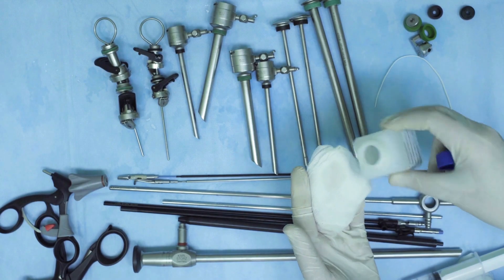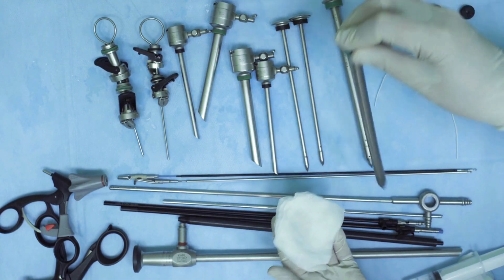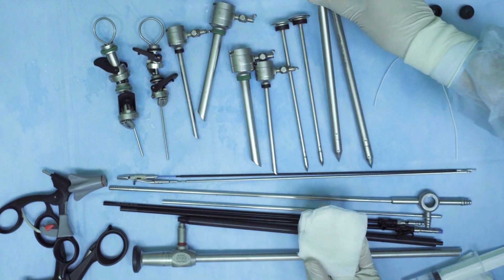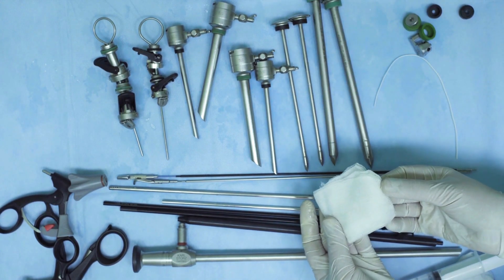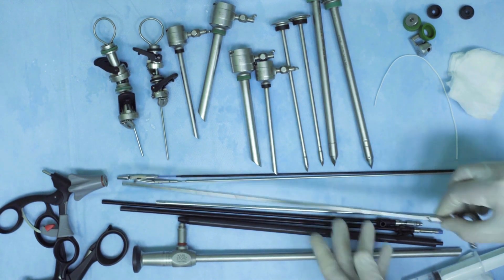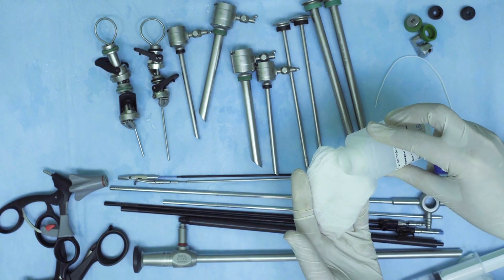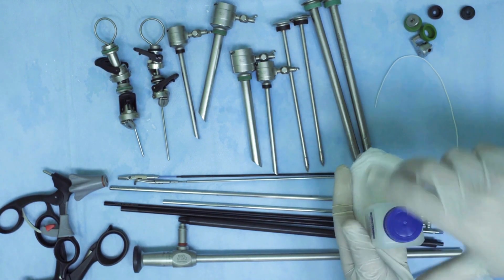Before any laparoscopic instrument is taken for sterilization or storage, it is important to first pre-clean it. The process of pre-cleaning involves the following steps. Number one, we first remove all the visible dirt, debris, or any organic matter stuck to the laparoscopic instrument using a soft brush or cloth.